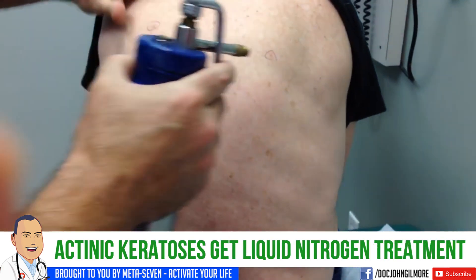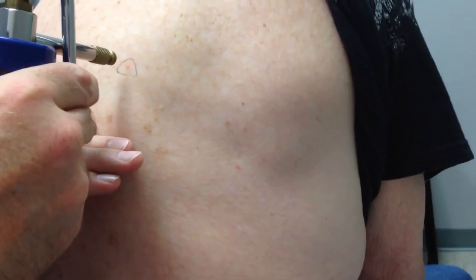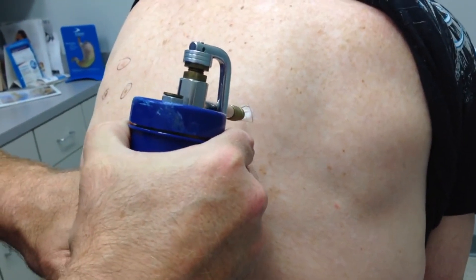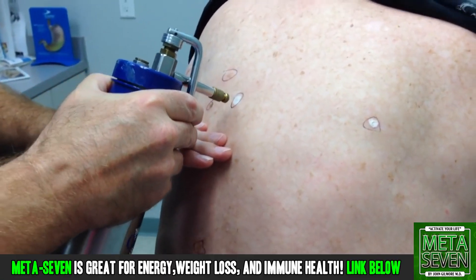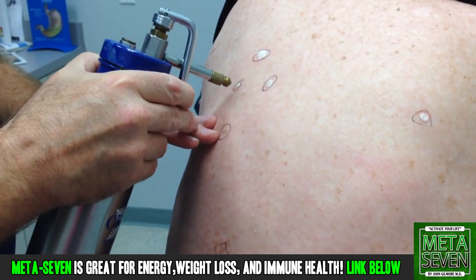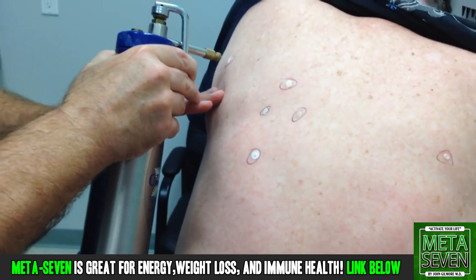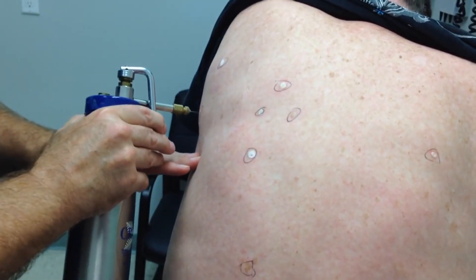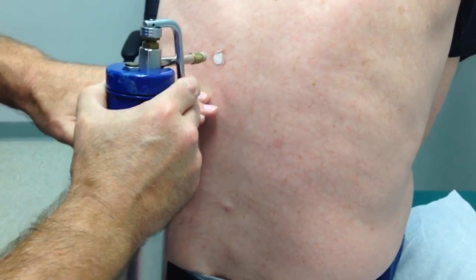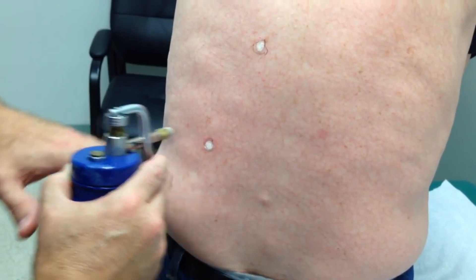We have to freeze all of these twice, okay? So here we go, get ready. This is gonna feel cold, but the most important thing is I won't feel a thing. Oh, actually it kind of burned — I'm getting close to the end here, just because I like my job.